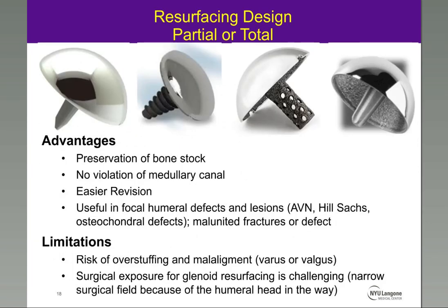Last but not the least, the resurfacing design, partial or total resurfacing designs, rely on fixation in the humeral head. Like the stemless design, they do not violate the medullary canal and are particularly useful in focal humeral defects. However, there's risk of overstuffing and malalignment, especially with total resurfacing of the humeral head. In addition, surgical exposure for glenoid resurfacing can be particularly challenging with resurfacing designs due to the humeral head in the surgical field.